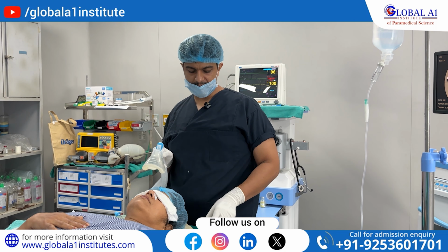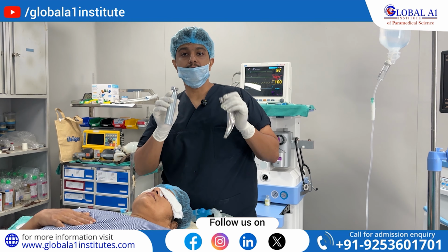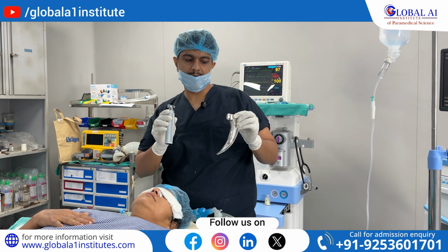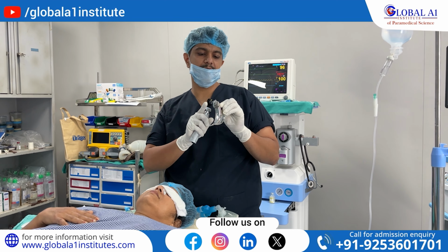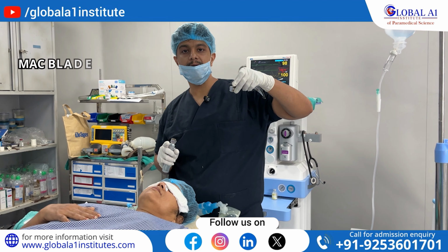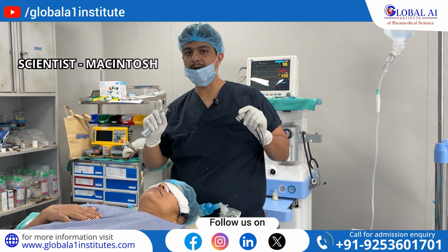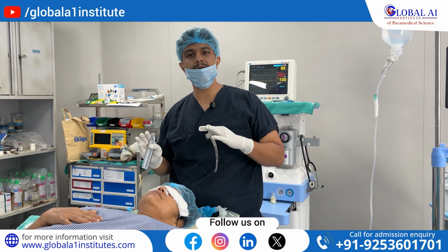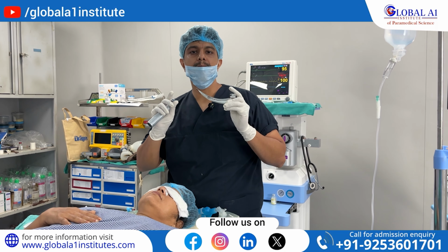And the main thing is this, as I told you, it is known as the laryngoscope, right? It is an adult scope, right? We have sizes 1, 2, 3, 4, and the maximum is size 4, right? It is called a Mac blade, named after Macintosh, right? In infants, in newborns, or in the younger group, we have a straight blade. It is called a Miller blade, right?